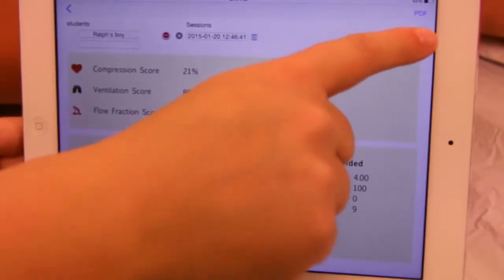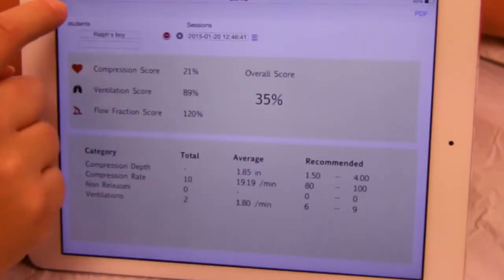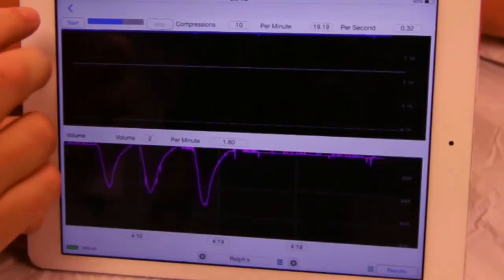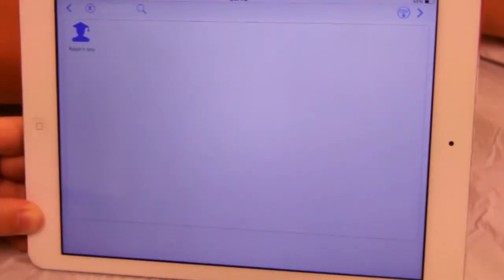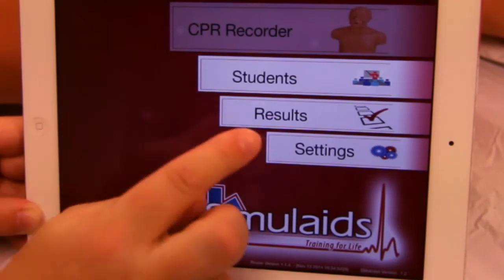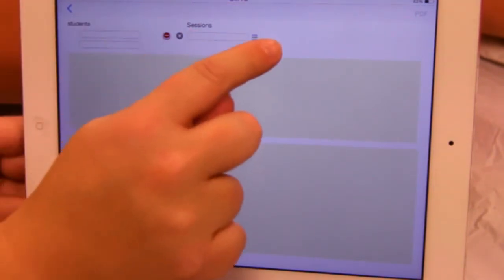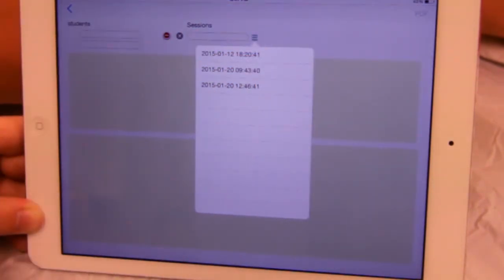You can also export the report as a PDF by tapping the PDF button. You can also access reports through the results button — note it shows the same report.